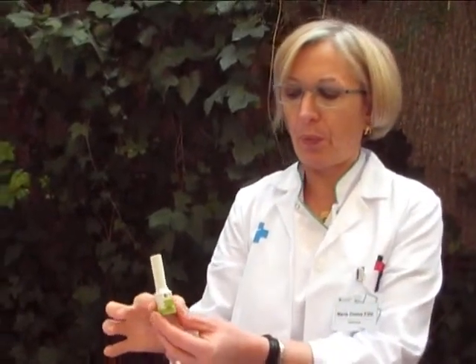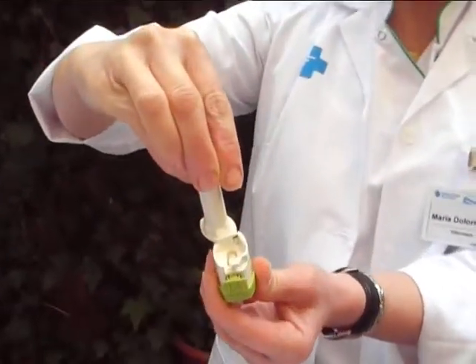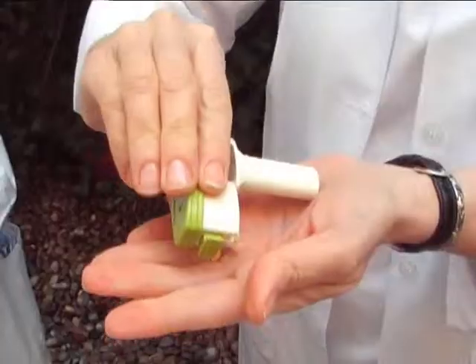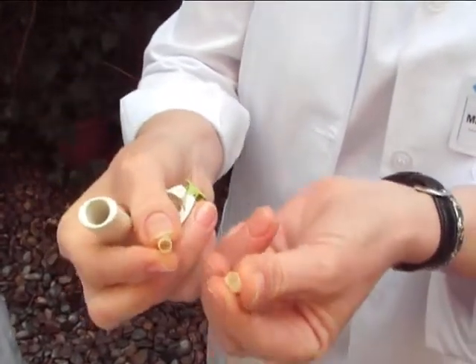You must hold your breath for 10 seconds with your mouth shut. Then breathe out slowly. Lift up the mouthpiece again and check that the capsule is empty. If it isn't, repeat the process.